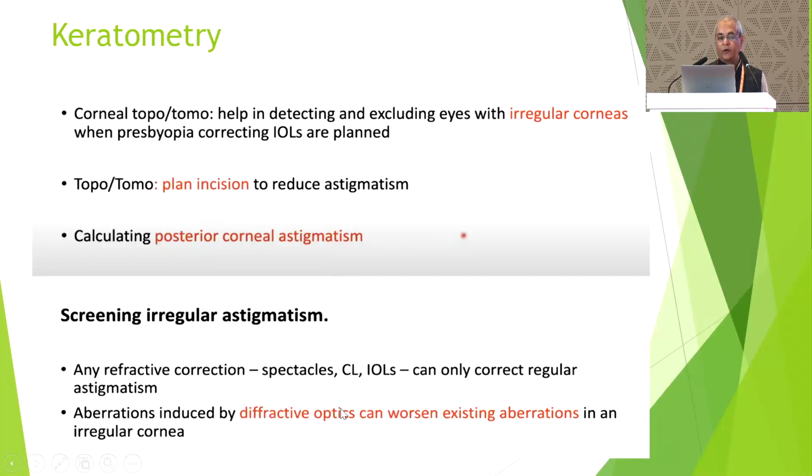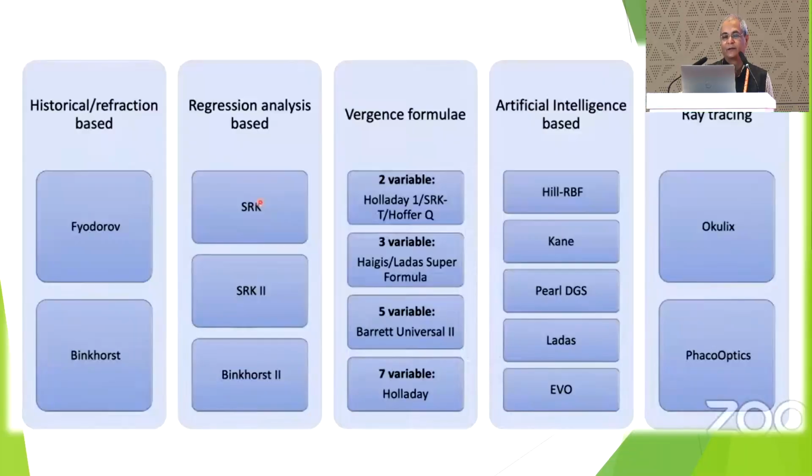The corneal irregularity is also very important. So if we have Pentacam, the aberration, like already the trifocal lens will have aberration, and if the cornea is already having aberration, it's going to compound it. So we have to be careful with that.